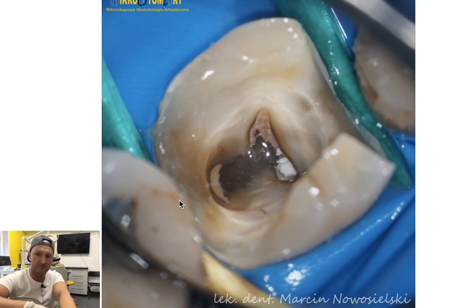First trick: when your teeth are so badly damaged and you want to use the rubber dam, wooden wedges help you a lot. If you just place them interdentally, they will hold your rubber dam and expose the margins of the teeth.